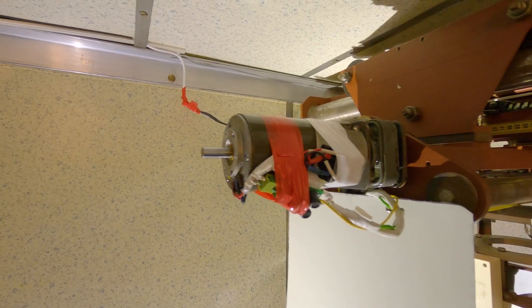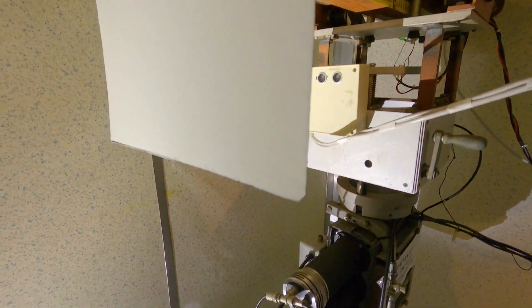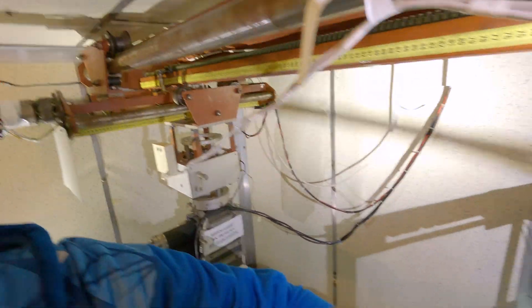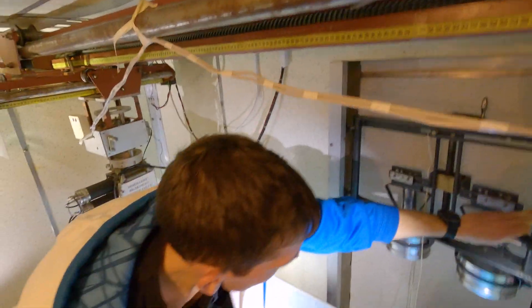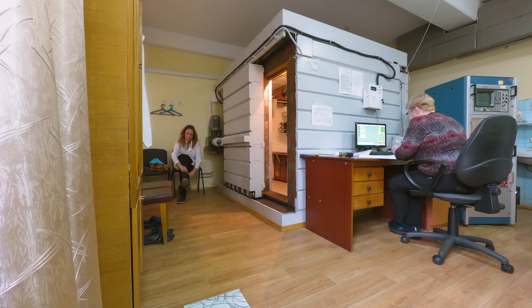The chest sensor — everything is made by hand, it's not standardized. They change it and tune it from time to time. Basically this is an invention; it's not something you just buy in a big store. It's a really cool thing to have here in Kyiv. We can see that even after so many visits, we still have pretty low levels of contamination.